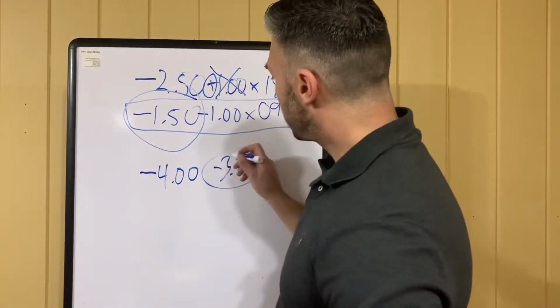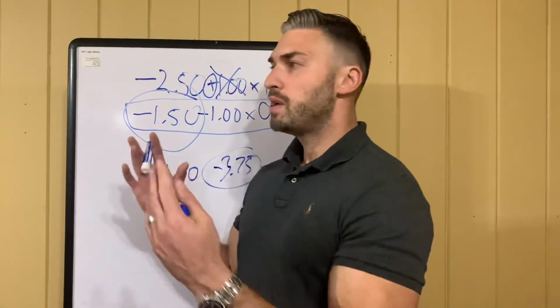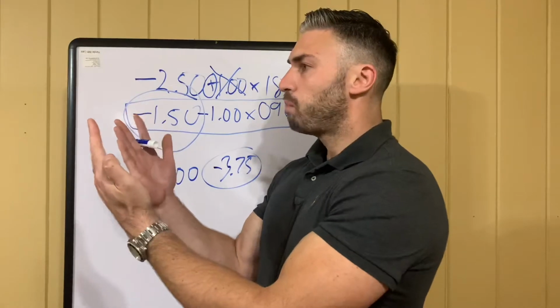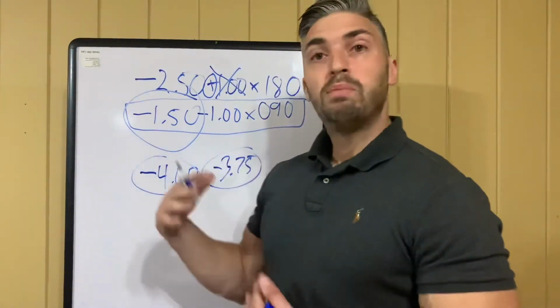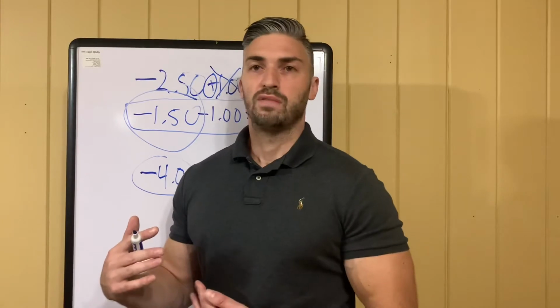So with contact lenses, we have to compensate for the fact that when someone's being refracted, that lens is out here. So we're putting it on the eye and we're making it more plus. If it's 4 diopters or greater, that could be plus or minus 4, you have to make it more plus to compensate for the vertex distance.